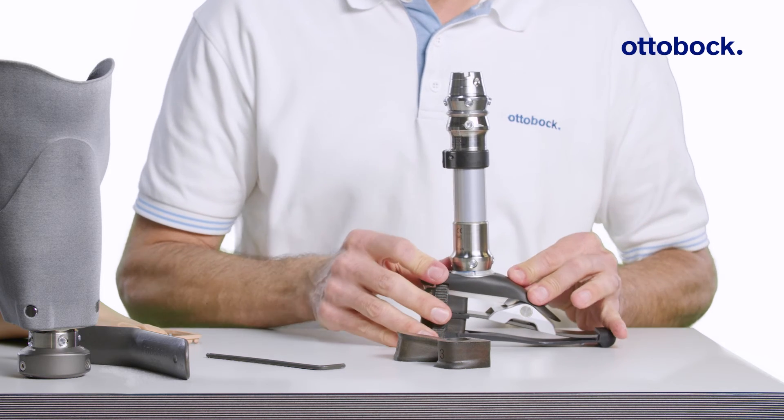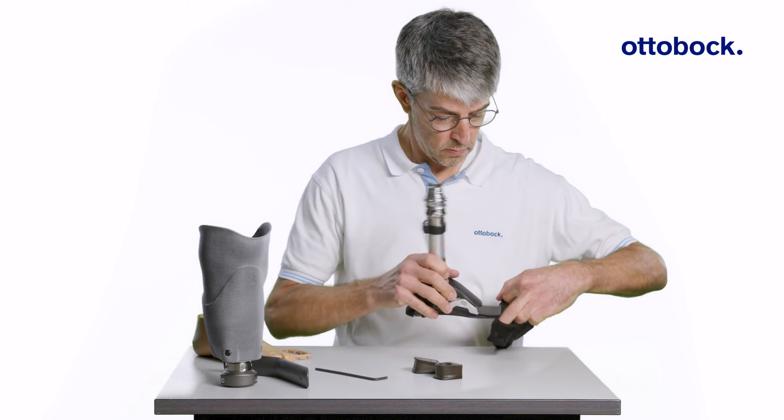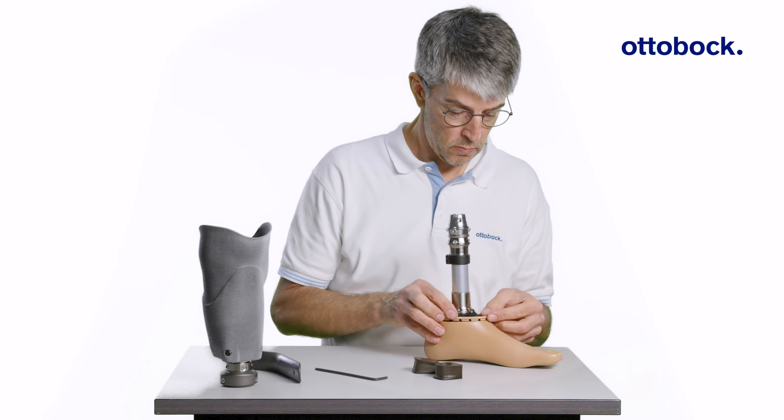Reapply the black cover making sure it snaps in place, then reinstall the spectra sock, footshell, and foam cover adapter plate.